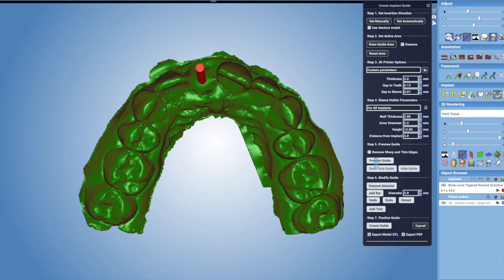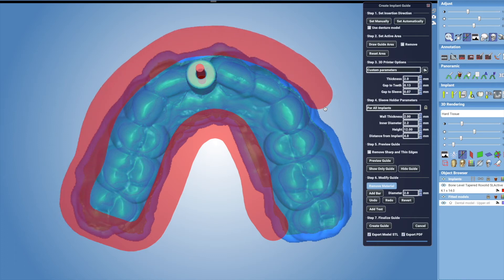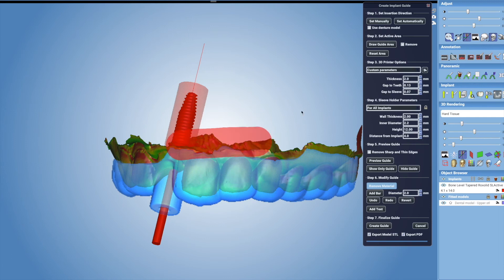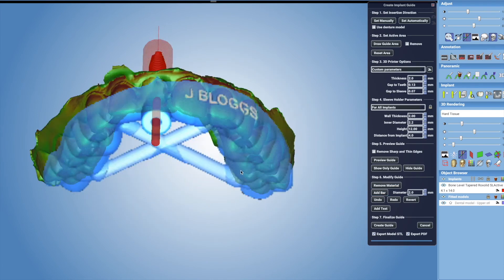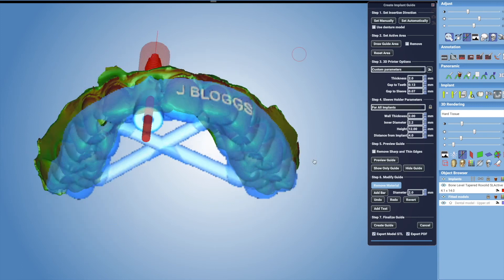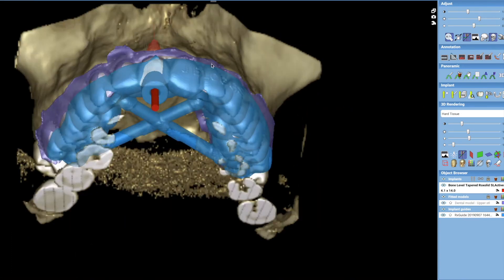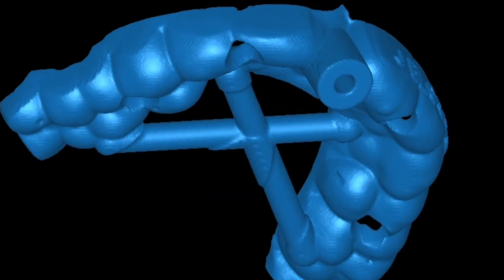The guide is then milled by our dental lab, who create the physical version of the surgical guide that we've designed digitally on the Romexis software. We then fit that into the patient's mouth during implant placement, and this way the ideal virtual implant position becomes the ideal position in reality.